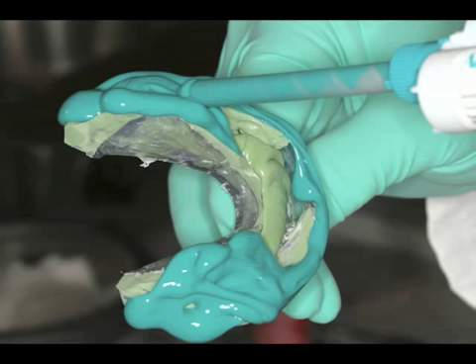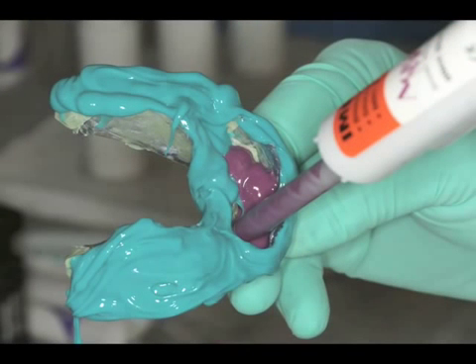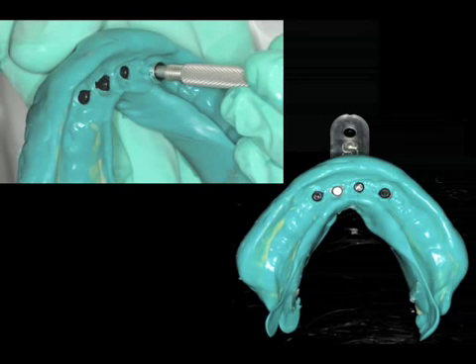posterior both sides. However, where the implants are, in order for them to be picked up, we're going to put a medium viscosity into the tooth channel. Not a lot, just enough to where this material will become rigid enough and assure you and I that when we remove the impression post will be inside of the impression and not still in the mouth. Now you can see our completed wash impression.